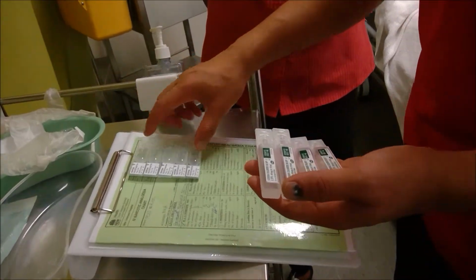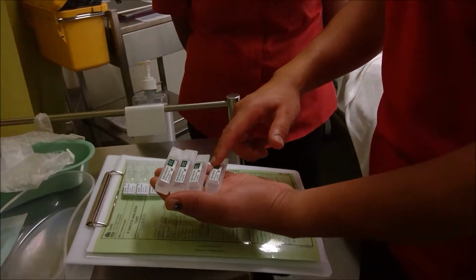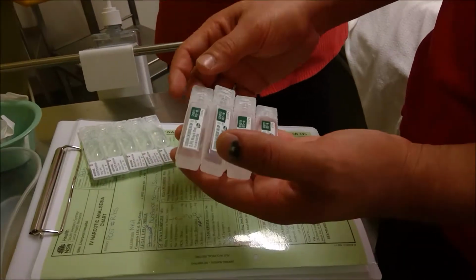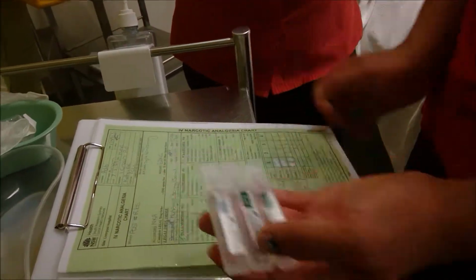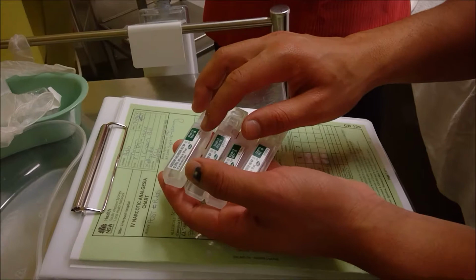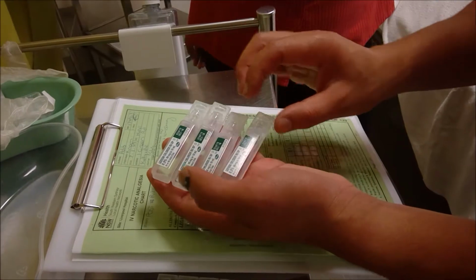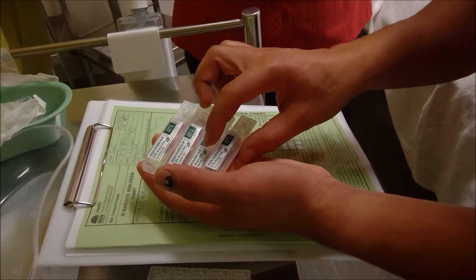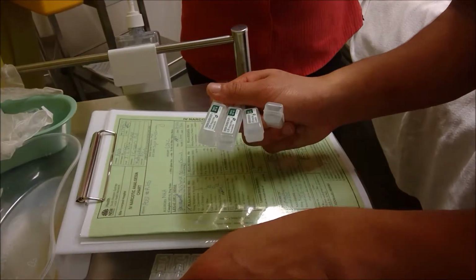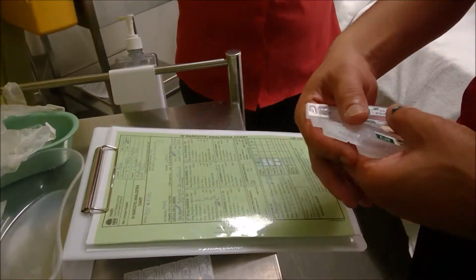With the 50 milligrams of morphine, which is 10 mils, we'll be using 40 milliliters of normal saline, which is compatible with the morphine, to make the 50-in-50 calculation. So we have normal saline. It expires in 2018, and it's 10 mils. We have four of these, each 10 mils and expiring in 2018. These combined will be 50 milligrams in 50 mils. Do you agree? Yes.